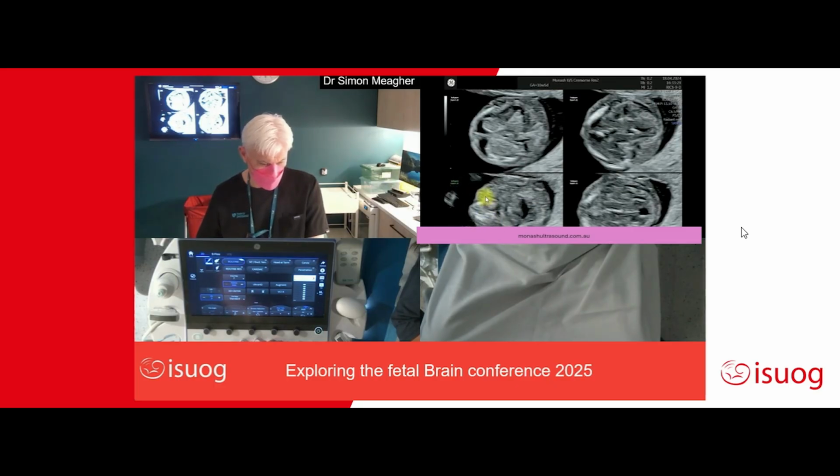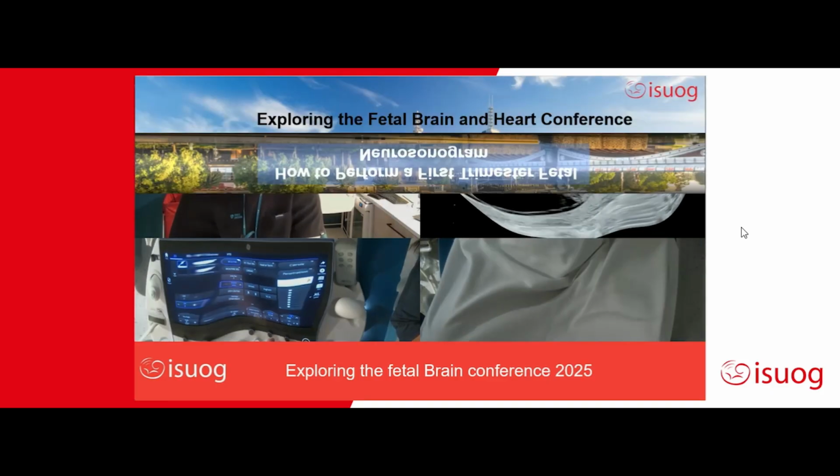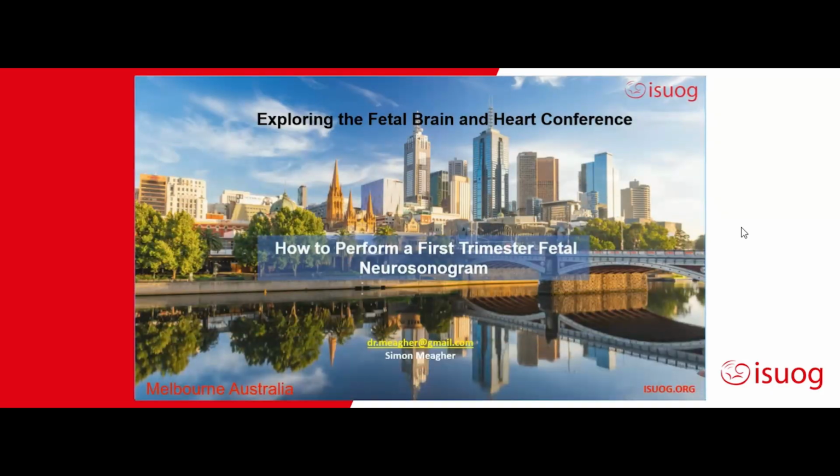You can also move on to looking at the maxilla and the mandibular gap, which is present and can be seen in fetuses at this stage of gestation. So I might stop there.